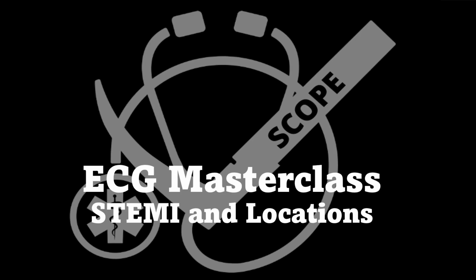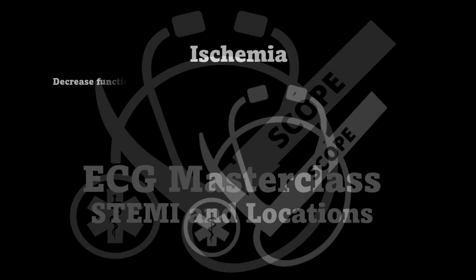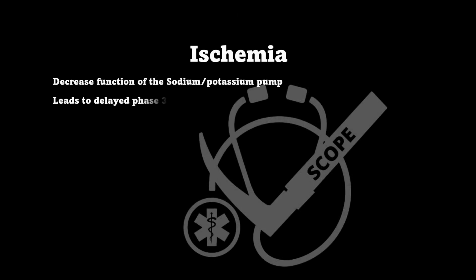Welcome to the STEMI and Locations lecture, where we will show various STEMIs and talk about their locations, and of course get a little nerdy. Now we'll talk a bit about ischemia. This can occur due to a stenosis or a plaque that is obstructing blood flow, which prevents nutrients and oxygen from getting to the heart.